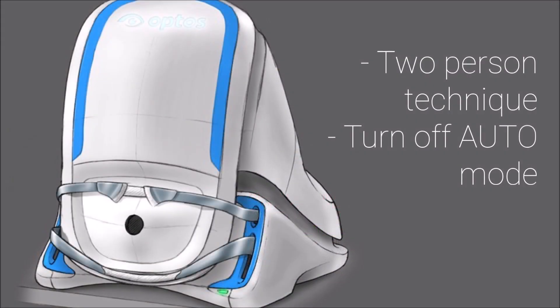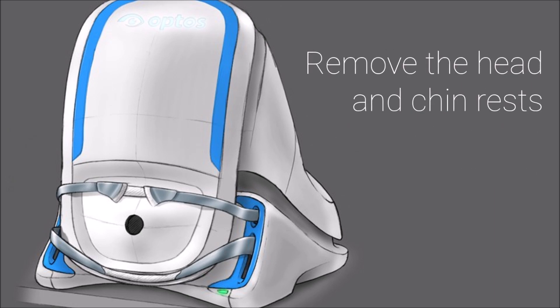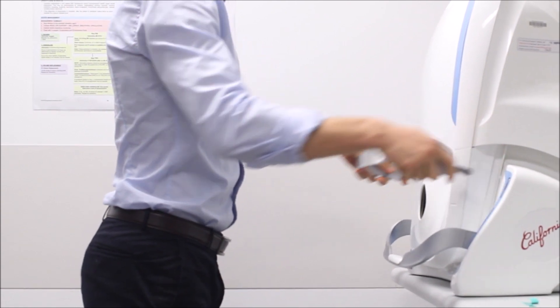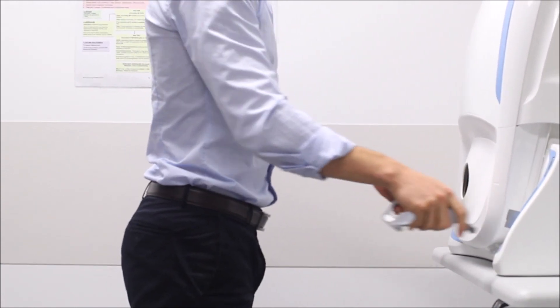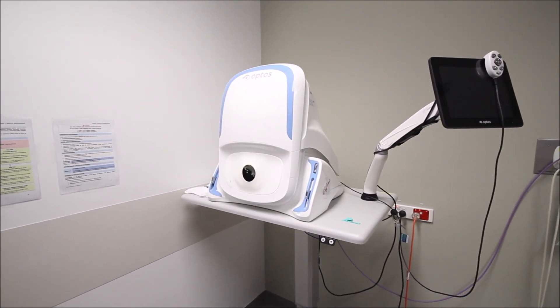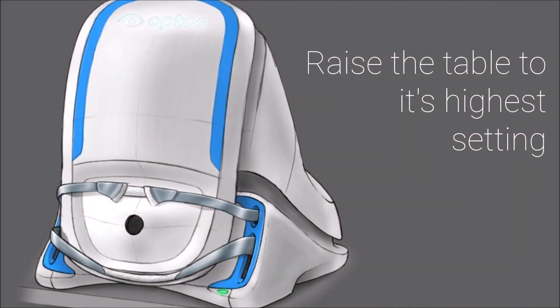For the best photos, two pairs of hands are advised with auto mode turned off. To enable the child to be in close proximity with the camera's aperture, remove the head and chin rest. Raise the table to its highest setting or to suit the operator.